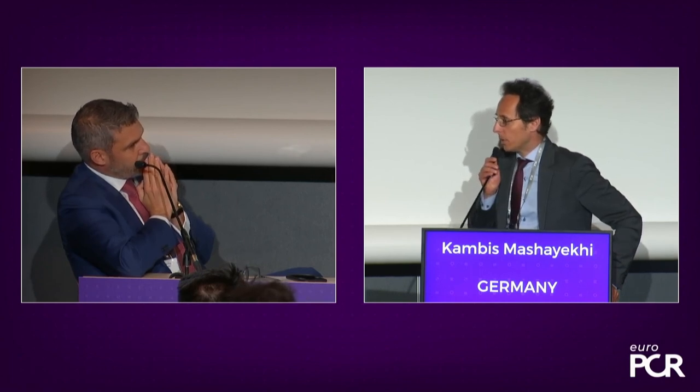I personally did not do that. I heard several examples. I somehow almost always find a solution to overcome it. There are plenty of solutions, right? There is retrograde dilatation nowadays with low profile 145 centimeter balloons. There's retrograde plaque modification with microcatheters, antegrade plaque modification. You can do external crush. You can even put laser on it. So you should overcome this scenario.